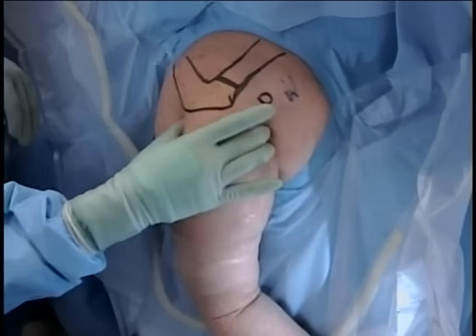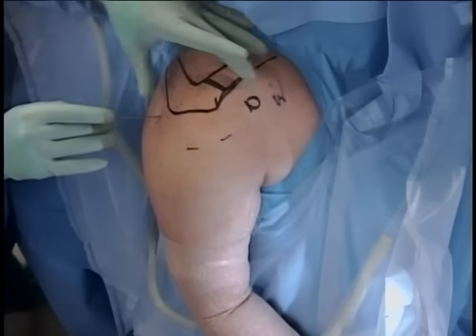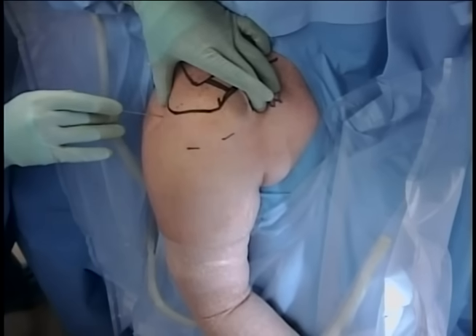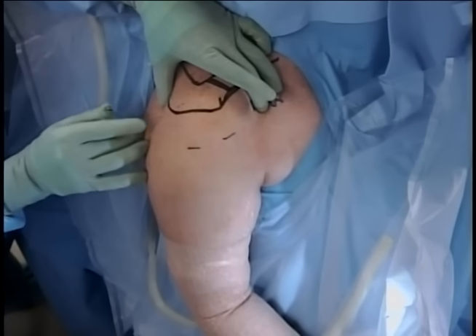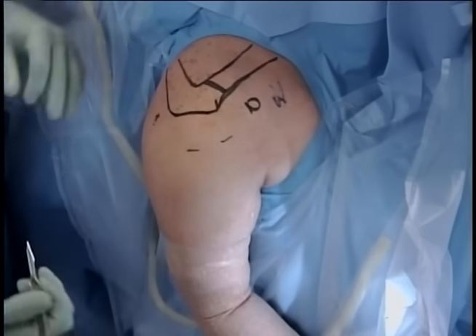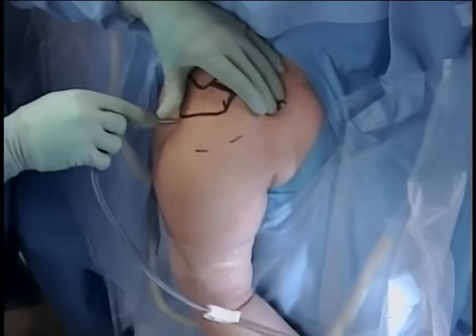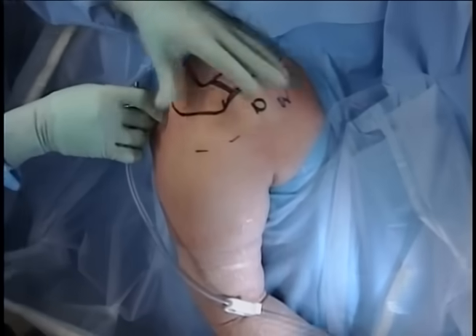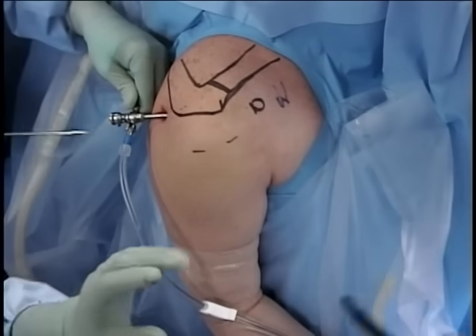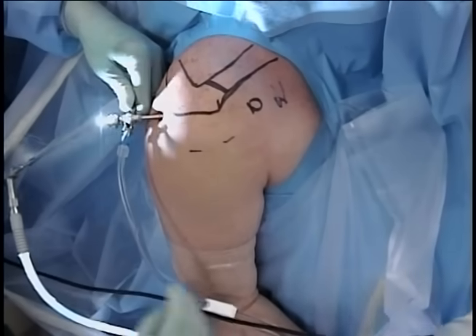palpate our glenohumeral joint. Our fingers grasp the humeral head. We next confirm the joint line with a spinal needle, and when it slides in easily, we use a scalpel to make our incision through which we will insert the arthroscope. We use a metal blunt cannula and insert this through the posterior capsule into the joint. We then place our camera through this cannula, and then we turn on our water supply.